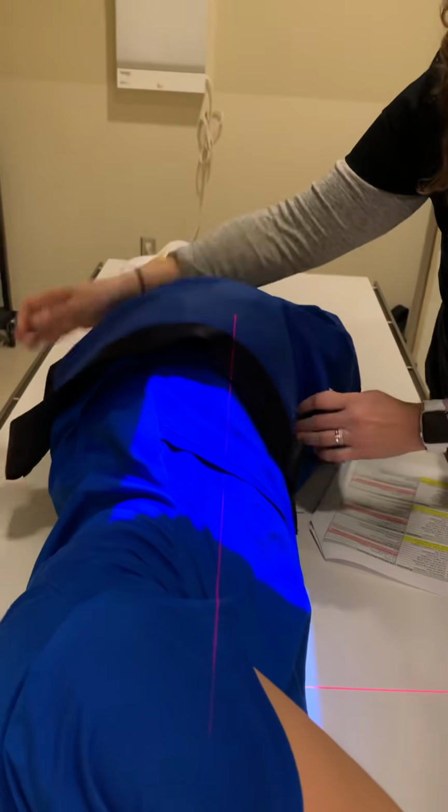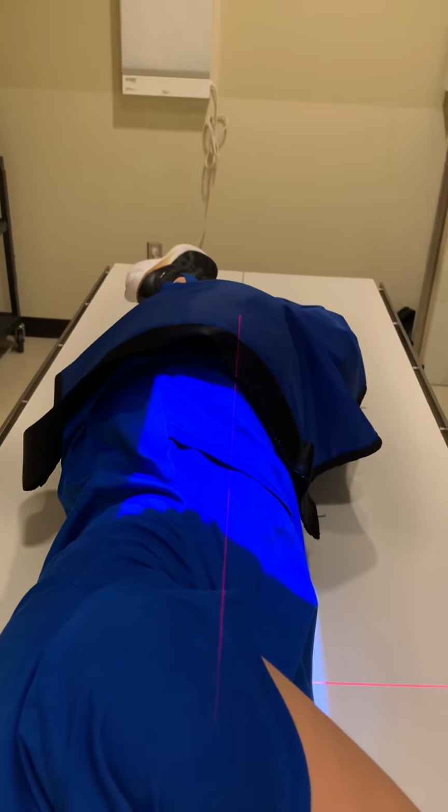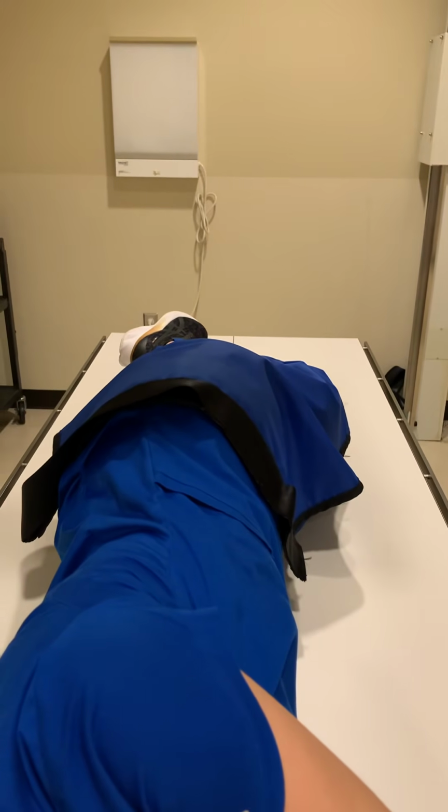We're going to collimate to the image receptor, and we want a right marker in the lower corner now because our patient's on the right side. We have lead shielding, and we're going to suspend breathing at the end of expiration. This is done for anterior and posterior parts of the stomach, the pyloric canal, and the duodenal bulb.